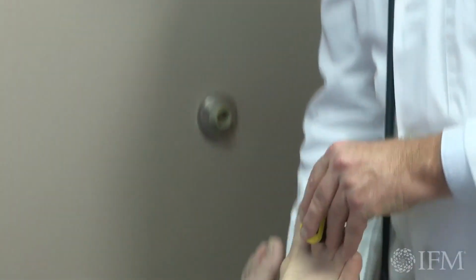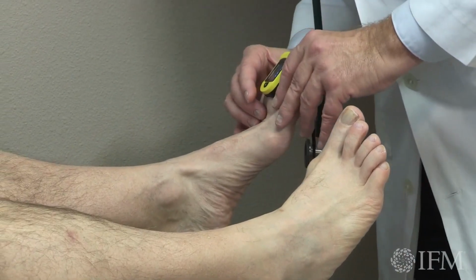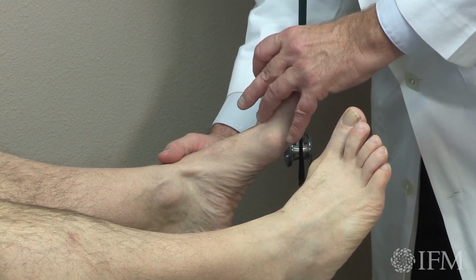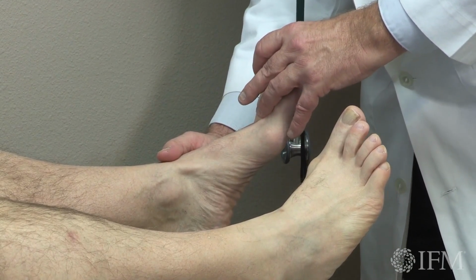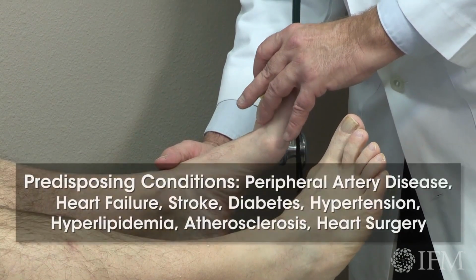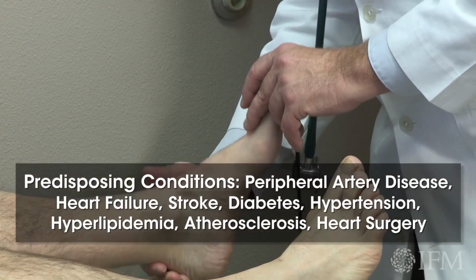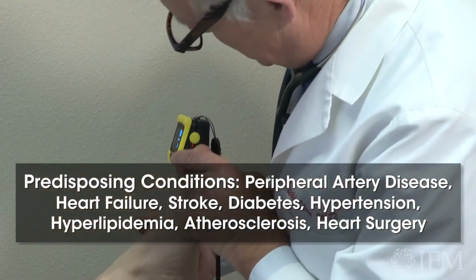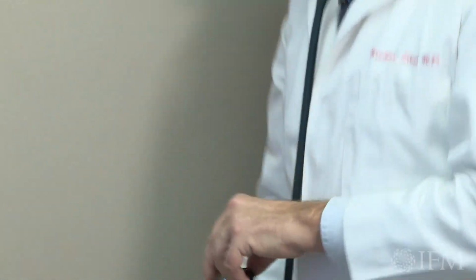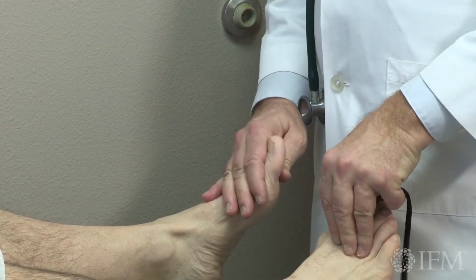And it did not. The reason I do that is it's a very quick test to tell if you have any issues with your blood vessels in your legs. And because you've had some heart disease and you had a procedure, it's always good to check the vessels in arteries farthest from your heart. And there's no indication there's a problem.